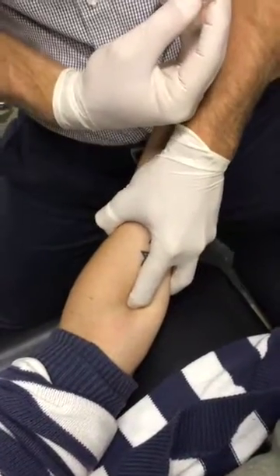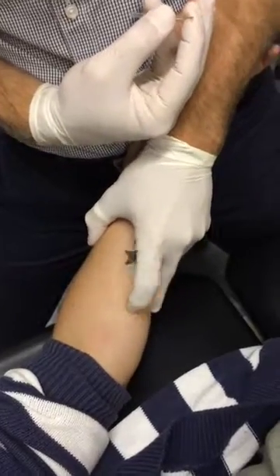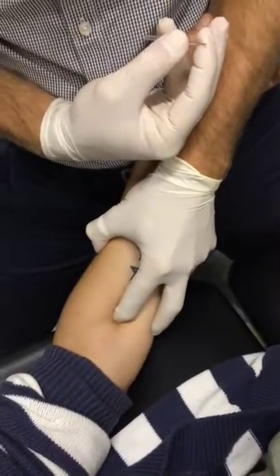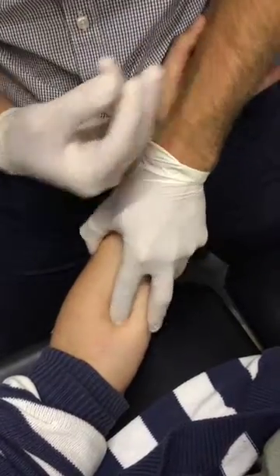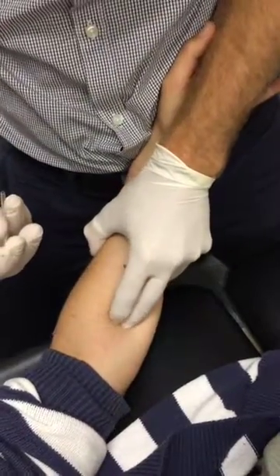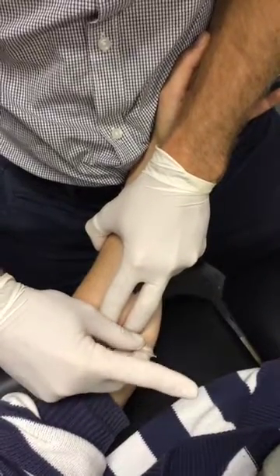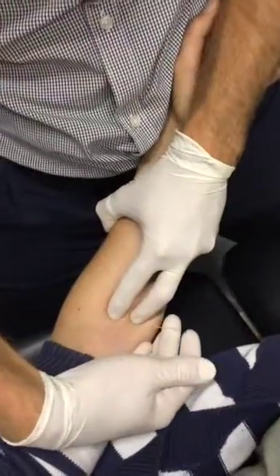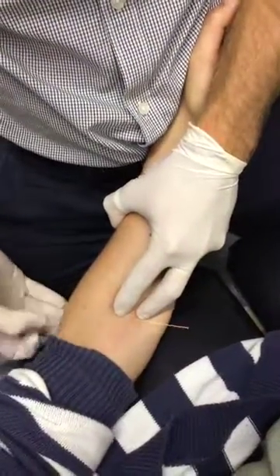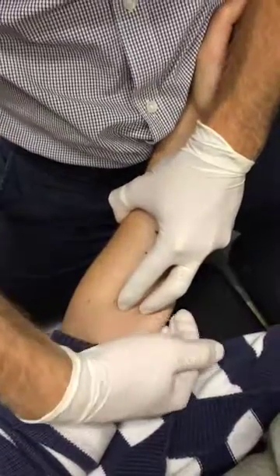Let's radially deviate. Yeah. Wiggly fingers — not coming up. This one is quite a bit deeper than pronator teres. So here, we're going at the radius — I think the radius is back here — so I'm needling kind of round through, directing around the back there.